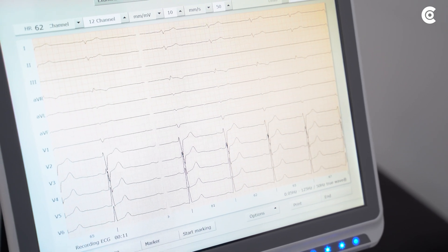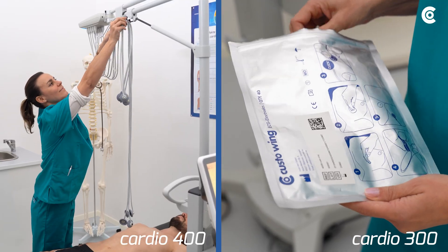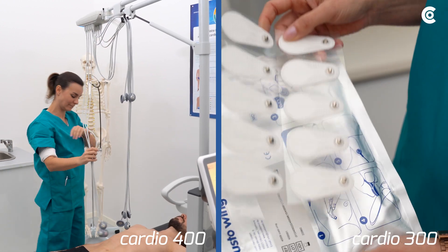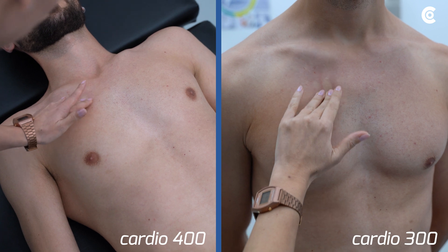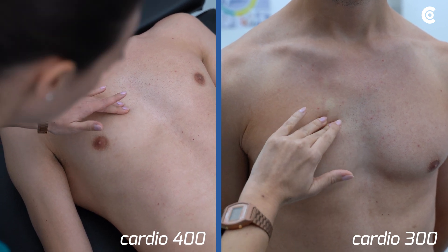Then place the electrodes according to Wilson. Use electrode spray when measuring with suction electrodes. The electrodes C1 to C6 are placed on the chest wall as follows.